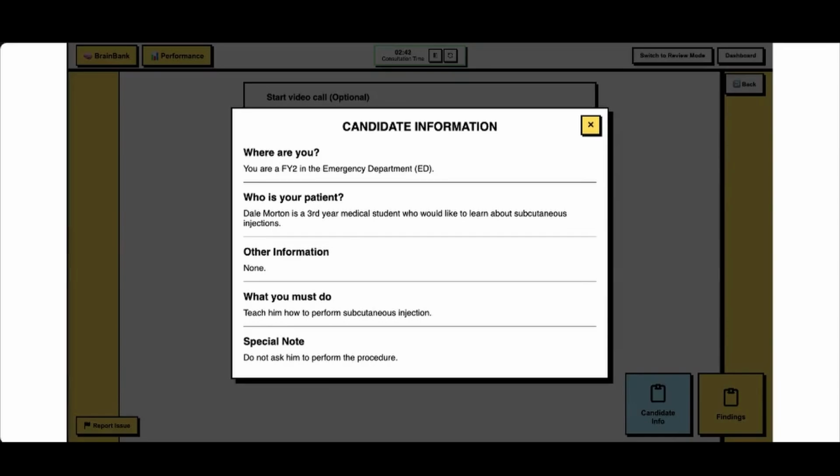All right. So like any procedure, you need to talk to the patient. When you see the patient, you create your rapport, you greet them, you introduce who you are, and after doing that, you confirm their name and their age, or if it's a patient that's not responsive or non-verbal, you can confirm with their hospital band and make sure the details match, because you don't want to be administering medication to the wrong person.